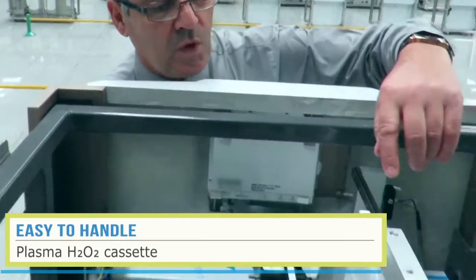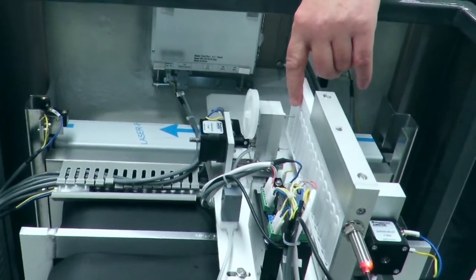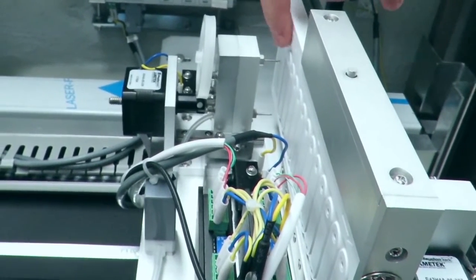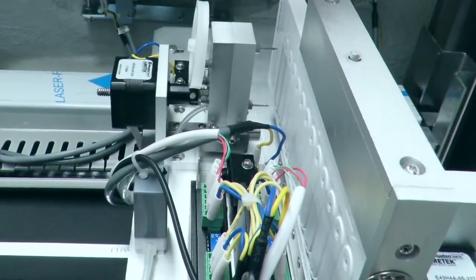Over here we have the cassette already in the machine. And if you can just see over here, these little needles — almost like an injection needle — these needles are going to penetrate into the cartridge and suck out the hydrogen peroxide into the machine.